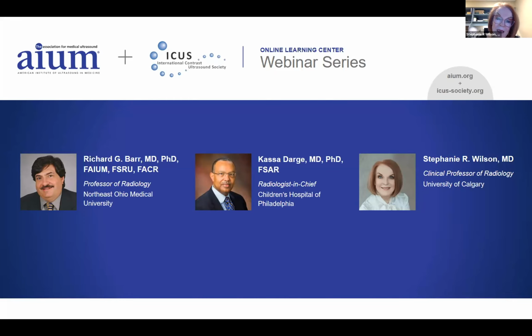And CEUS, by comparison, first, we have a better capability to communicate with the patients, even small patients, and they understand better about staying still. In addition, quiet breathing and even considerable motion does not destroy an ultrasound scan. So we have a very, very big advantage in terms of motion artifact, which destroys MR almost completely.